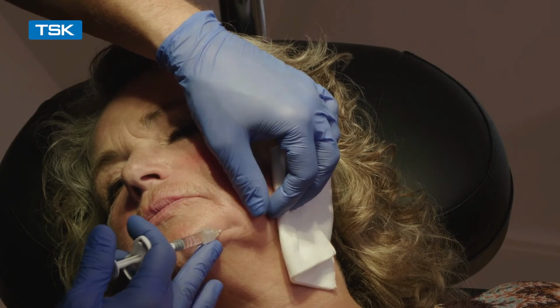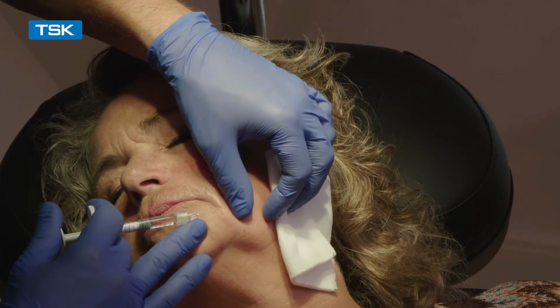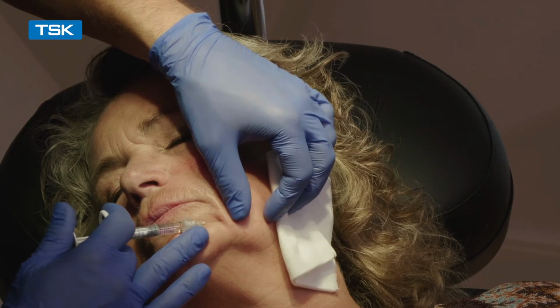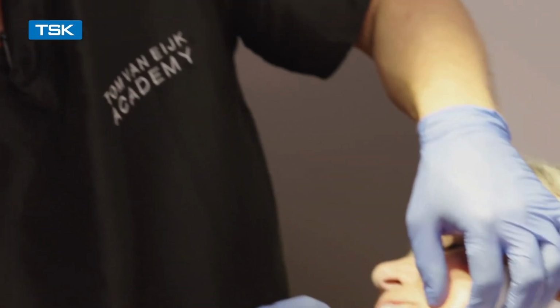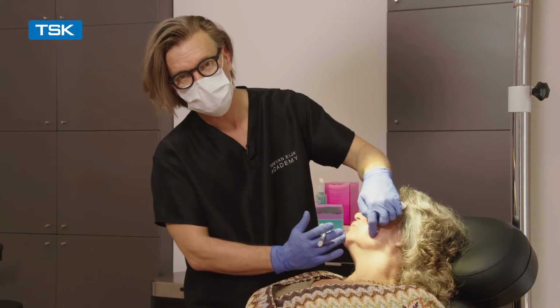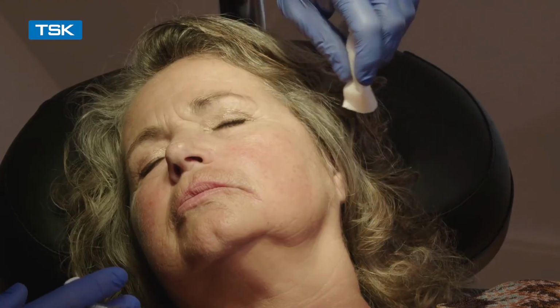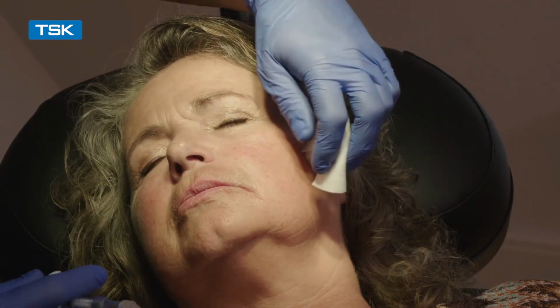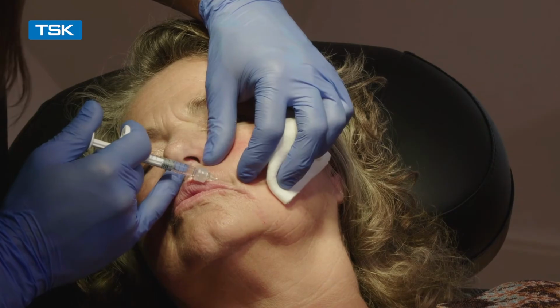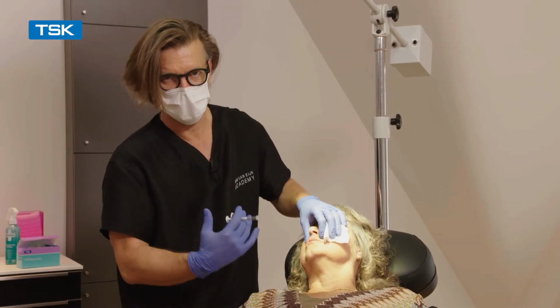In order to strengthen the jawline, it's important to address the marionette folds. And the folds themselves will indicate where strength is needed. So you see, it takes a lot of injections and just a little bit of product to strengthen the dermis in this region. And this is all preparation of the actual augmentation of the lips we're going to do. It's essential to hit the dermis only if you want to strengthen the skin, since if you go underneath the skin, you will give a filling where you don't want to.